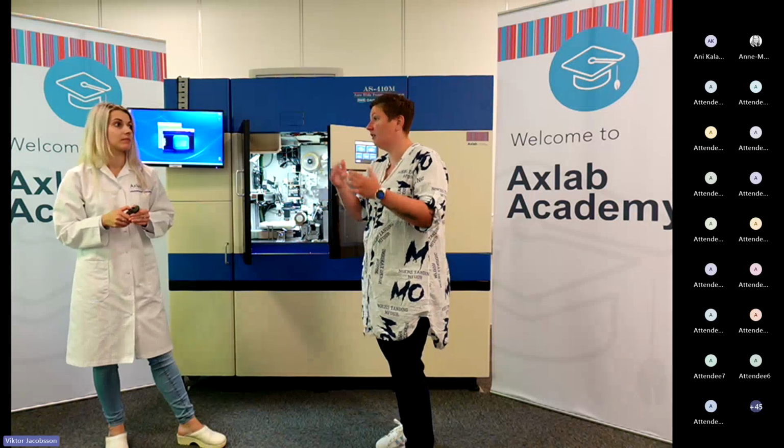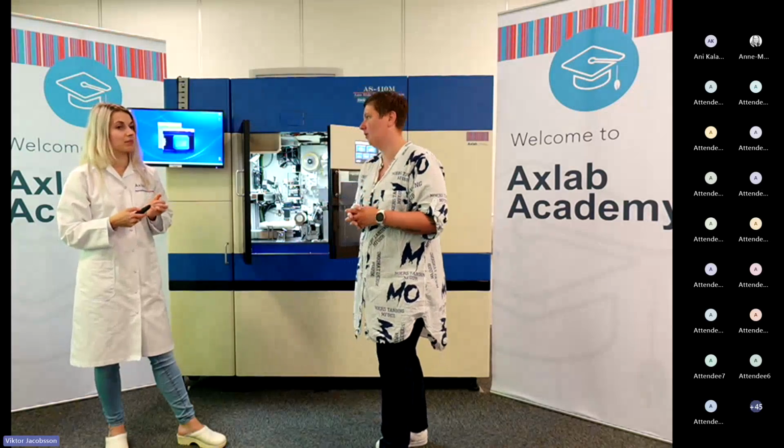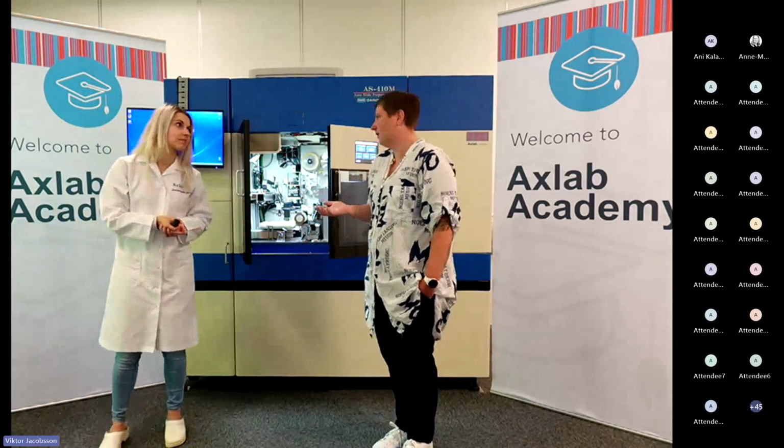So in a perfect world, everything would run on it, but there will be some types of specimens where we can remove every level that the pathologist will have, but we have tried to have that. And sometimes I have a pathologist saying, "Can I get this on the machine? It's cut so beautiful." And I'm like, "Yeah, if you remove all levels and only have one level on it." Unless you're open to the idea of having levels on multiple slides. Exactly, but then it's mostly because of the scanning, and again, you will use more slides.